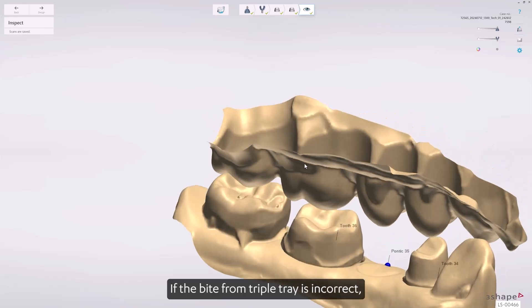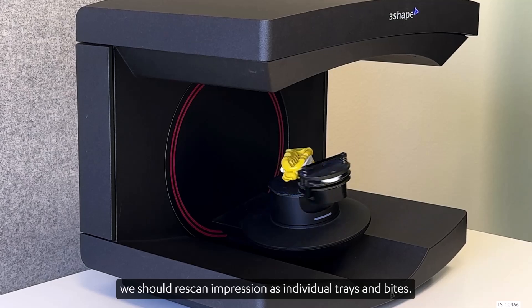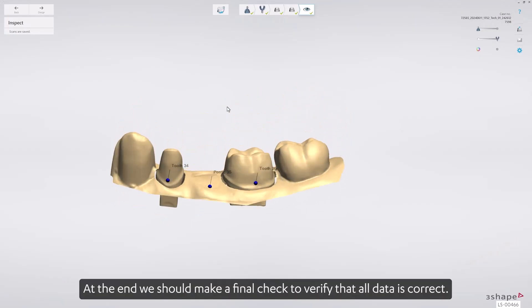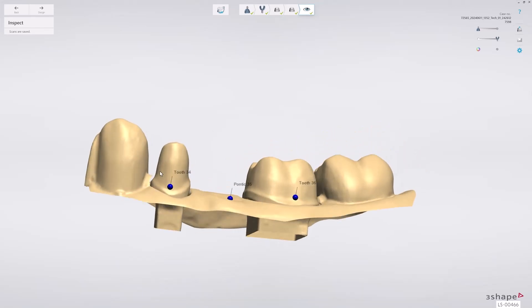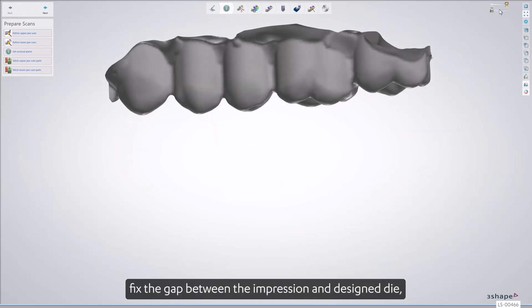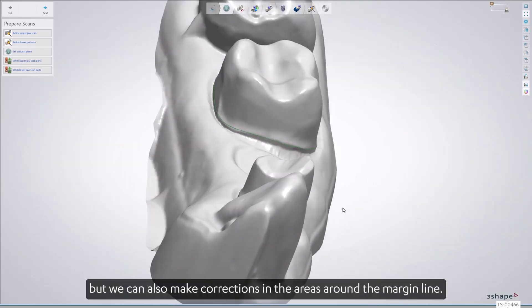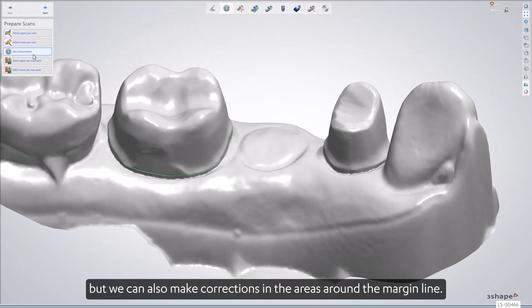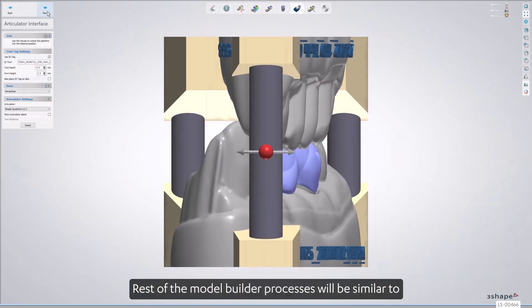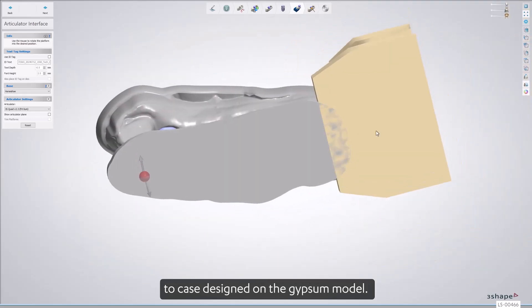If the bite from the triple tray is incorrect, we should rescan the impression as individual trays and bites. At the end, we should make a final check to verify that all data is correct. In Model Builder, the software will try to fix the gap between the impression and the design dye, but we can also make corrections in the areas around the margin line. The rest of the Model Builder processes will be similar to a case designed on a gypsum model.